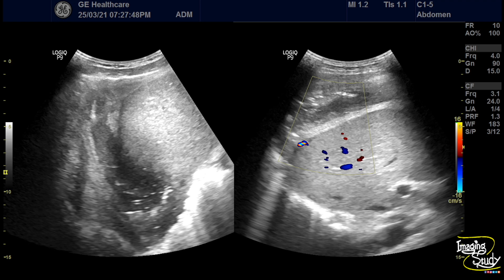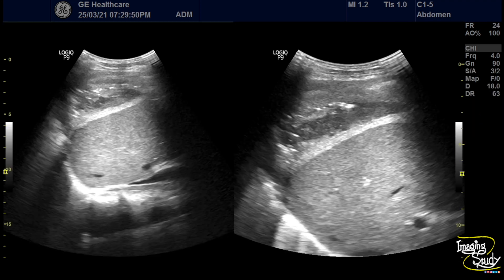On the left image, you can see the abscess above the liver and below the diaphragm. On the right image you can see it from the subcostal view with color Doppler — there is no flow within, but the adjacent area was inflamed. Here is the picture from the subcostal view showing the abscess.